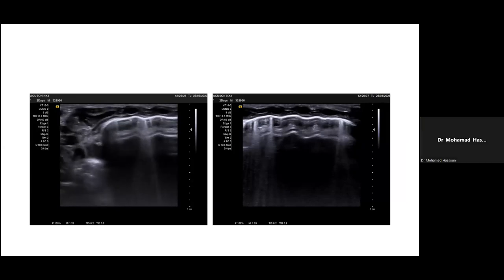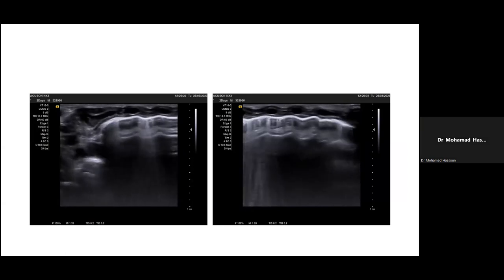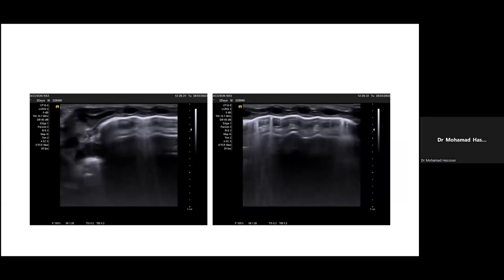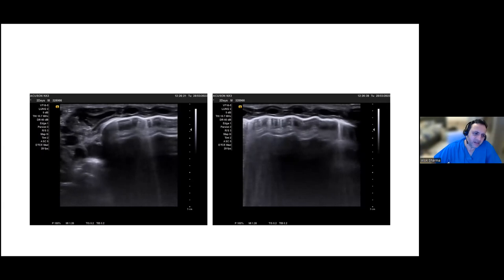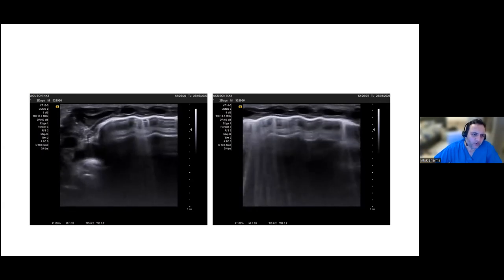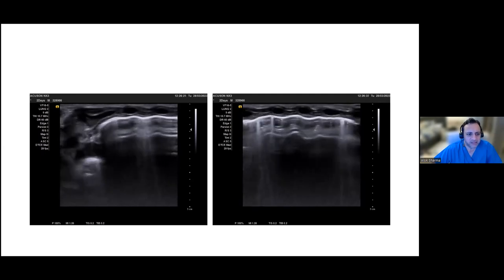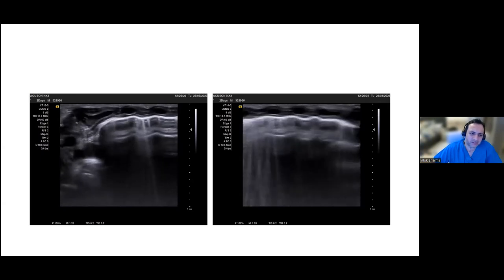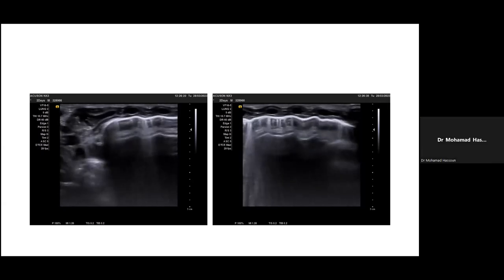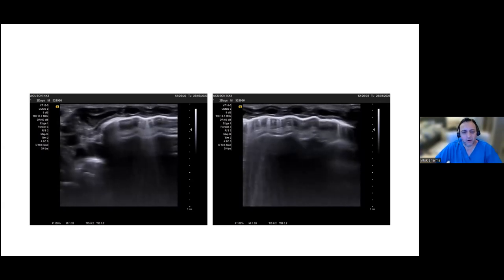L1, nothing special. Also some B-lines, A profile, good pleural sliding. R2 also, same. I didn't find any consolidation. So I don't know, Alok, if you find anything else. But my only comment when I look at your first set of images is that while a lot of the regions really look like you have double lung points in some areas and a reasonably decent pleural line that looks regular, there are subpleural consolidations. And the real question I'm asking is, once you say there are subpleural consolidations, you tend to edge towards a diagnosis of RDS.